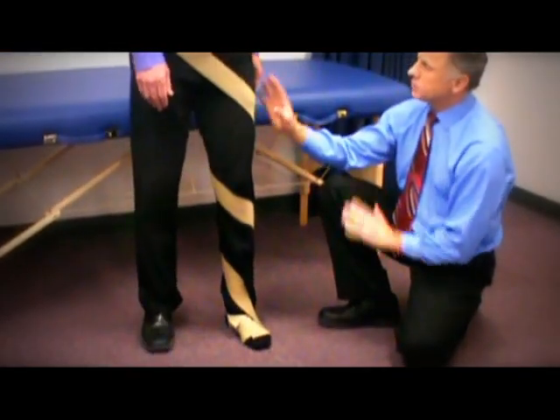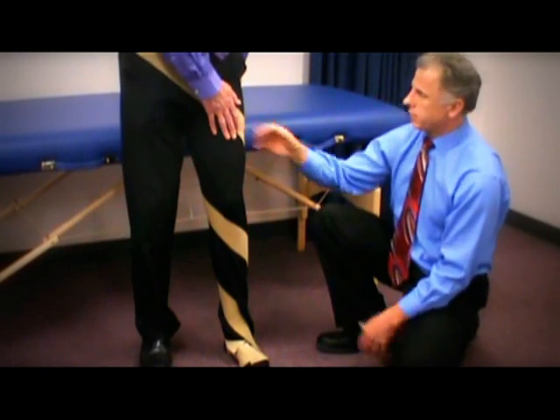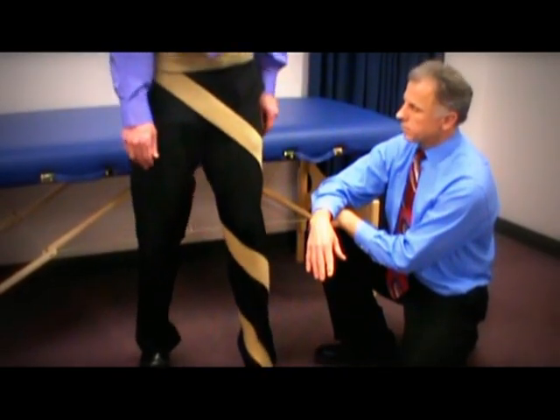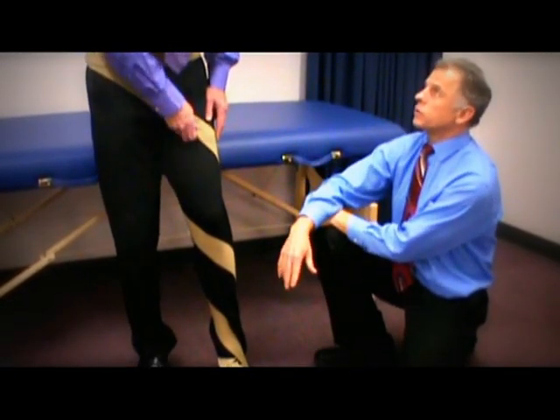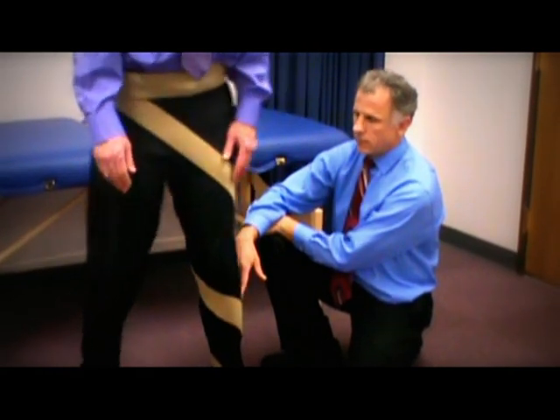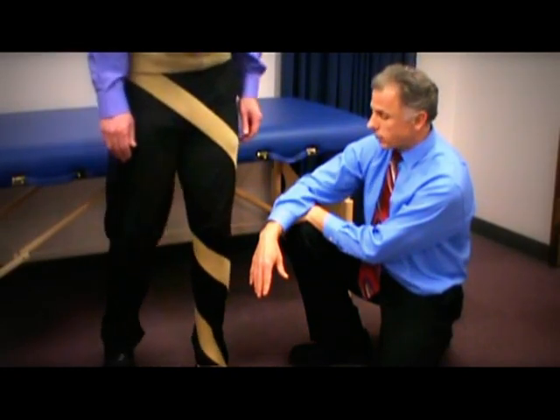And muscles just have a tendency to contract when there's pressure put on them. My muscle is getting feedback. It's kind of why we do those things called tapping and stuff like that. It gives feedback to the muscle and helps it work. So we're turning this in and I'm feeling that nice pressure on my quad to help it want to kick in when I'm walking, so it doesn't just collapse like this. Matter of fact, later today I'm going to use this very one on a patient with a CVA or stroke, and I have a feeling we're going to have good luck with it.